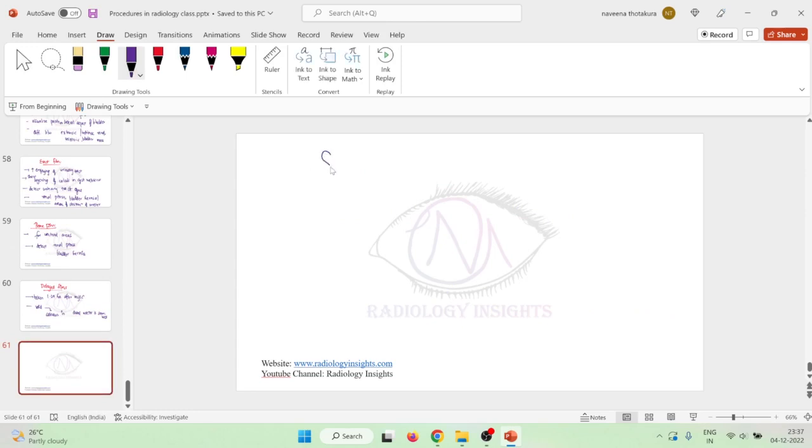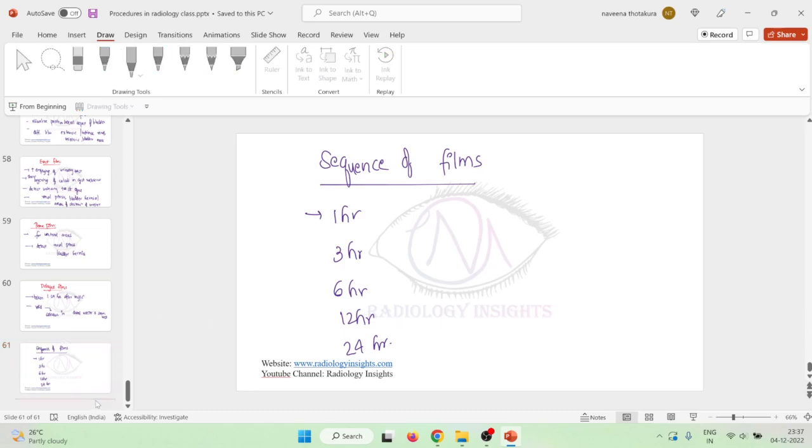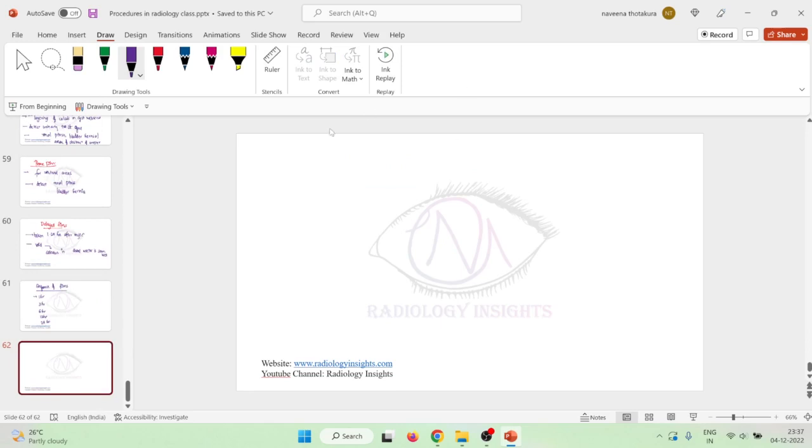Then, the timeline or sequence of delayed films taken in intravenous urogram: we take films after 1 hour, 3 hours, 6 hours, 12 hours, and 24 hours. Now, when do you actually use the delayed films? These are the uses of delayed films.